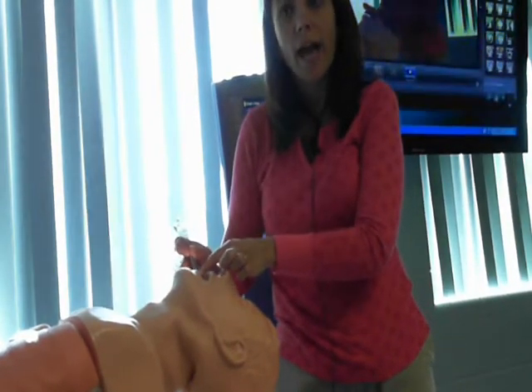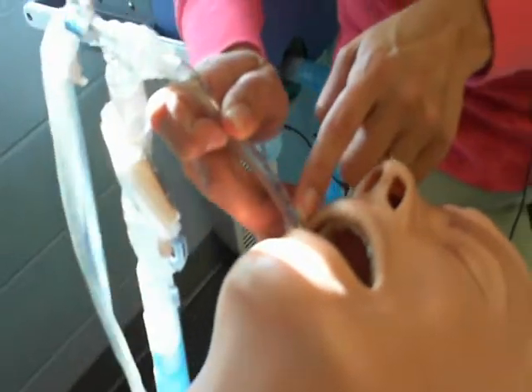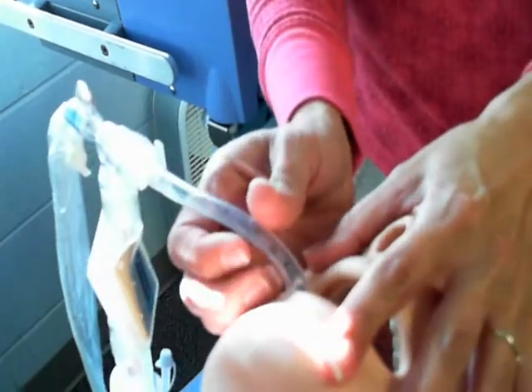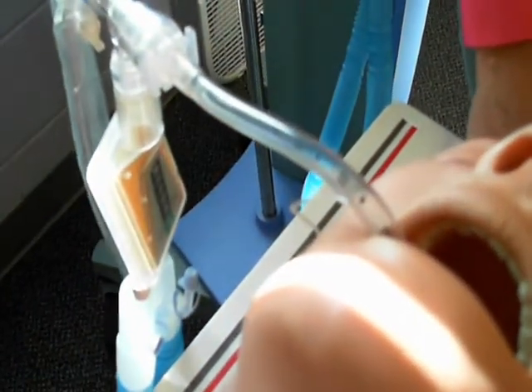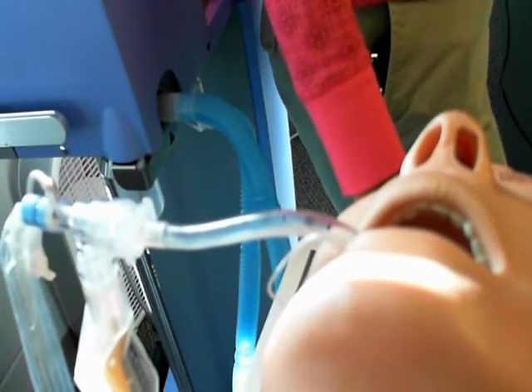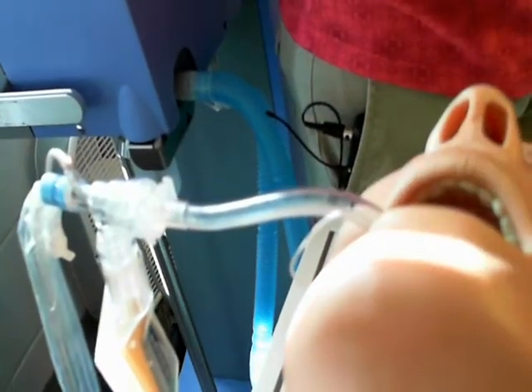Okay? So, I don't know if Marcia can zoom in so you can see. But this endotracheal tube has tube markings. So this patient is at a 21 at the lip. So when you come on shift, there's going to be tape, and you need to look at it and say, okay, it's about 21. Because what can happen when you try to roll this patient is this tube can slip out, it can be pushed in, and that can affect whether the tube is in the right mainstem bronchus or if it comes above the vocal cords. If it comes above the vocal cords and we lose it, we don't have a way to ventilate that patient without reintubation. Okay? So know the position of your endotracheal tube.